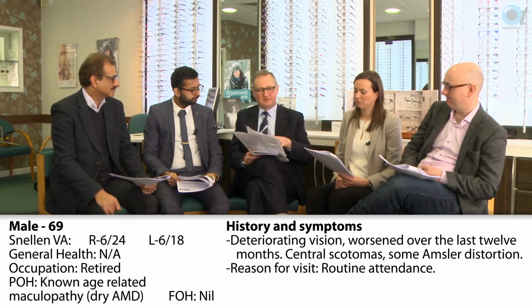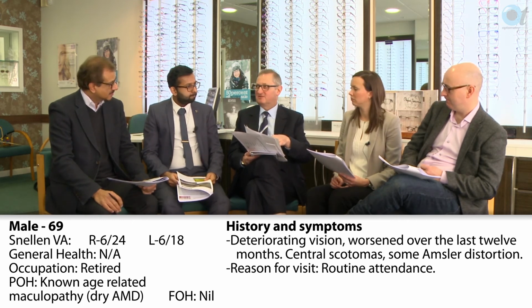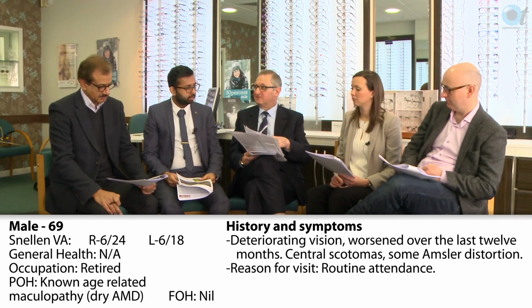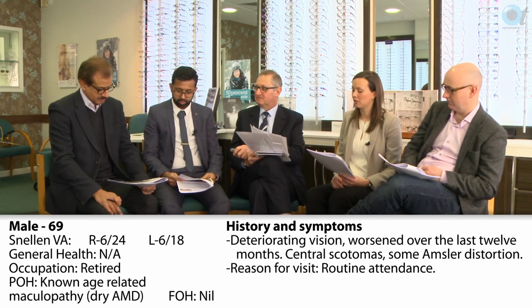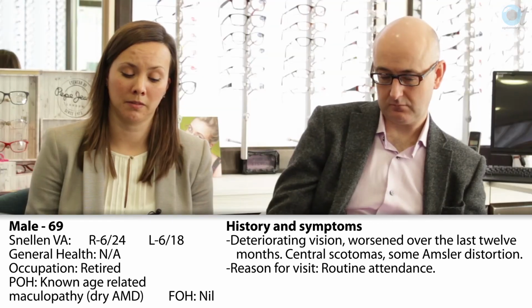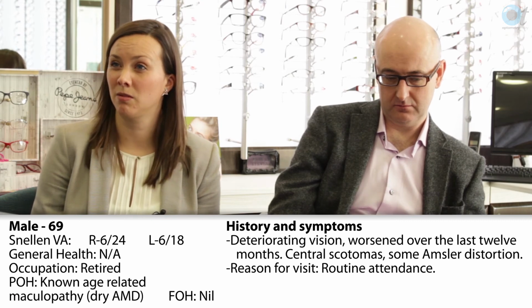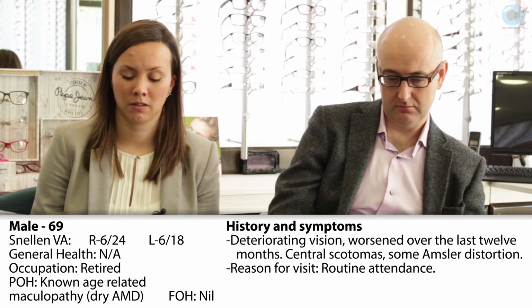I mean, the inference from the case history is that he's come for a routine attendance, so we might be lucky enough to have an Amsler from previously, or a fundus image. So do you think, looking back at the records, that would be a guide to help us? Very much so. What the vision was like last time as well. I think I'd give him an Amsler, ask him to note if it gets worse at home, repeat the OCT in say a month or maybe even 6 weeks, probably a month.